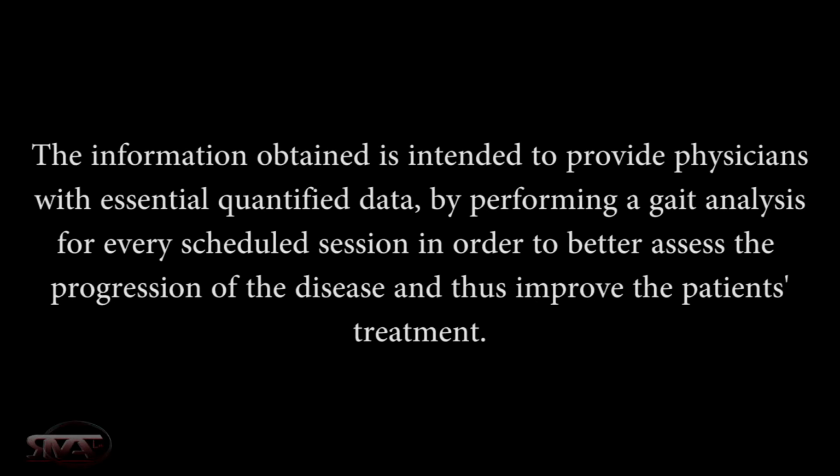The information obtained is intended to provide physicians with essential quantified data by performing a gait analysis for every scheduled session in order to better assess the progression of the disease and thus improve the patient's treatment.